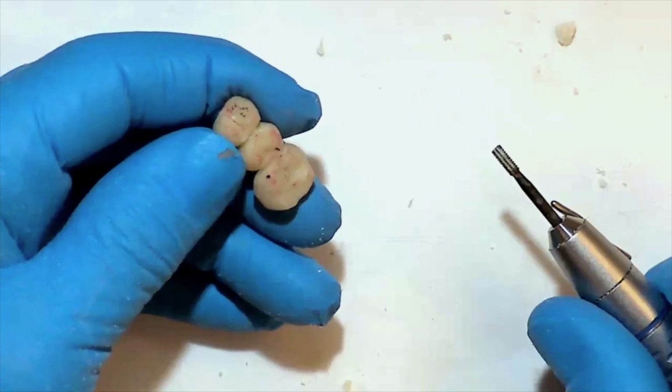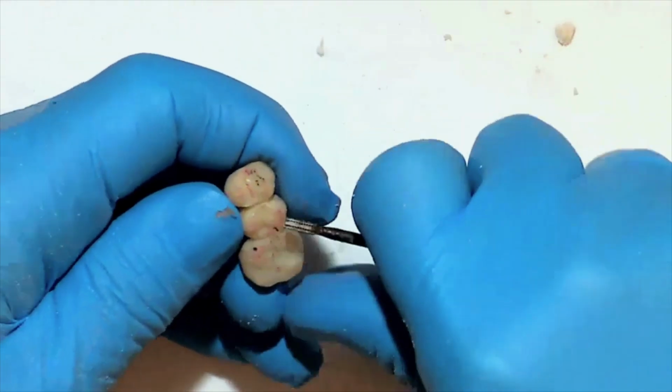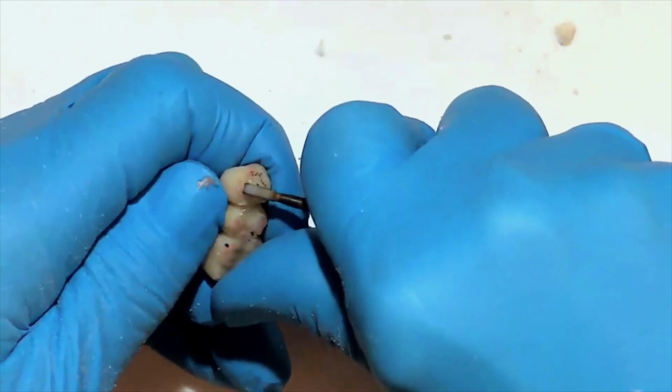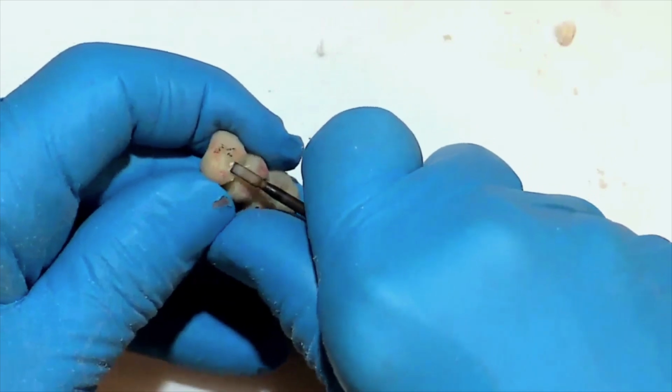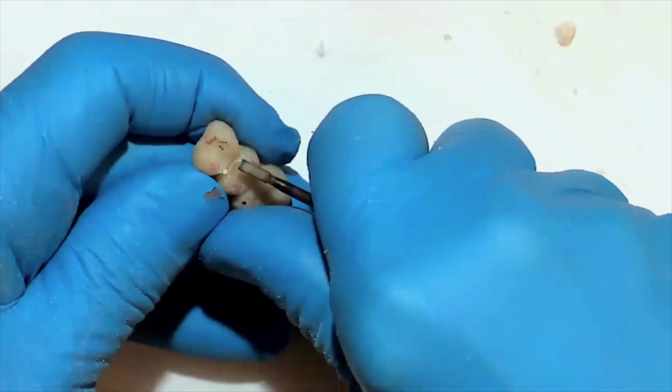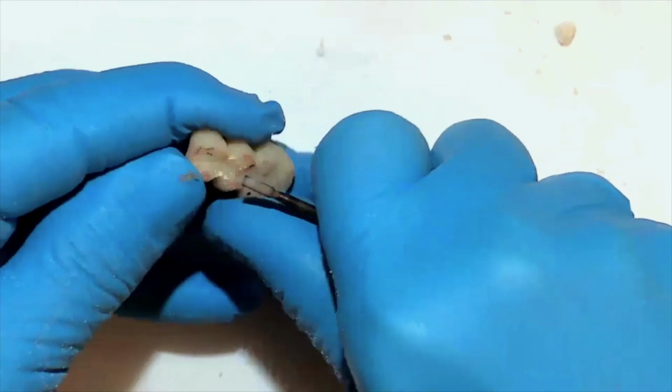I'm now switching to a straight crosscut Fisher burr, which I like for defining the anatomy a little better, grooves and fissures, and creating a better looking anatomy on the teeth. I want to be careful at this point not to be touching areas you shouldn't be touching, such as the centric holding cusps.